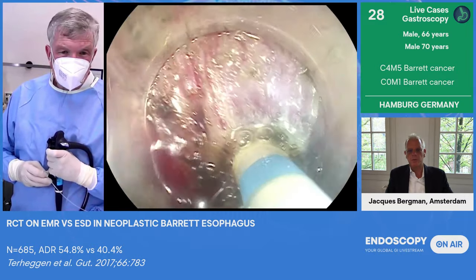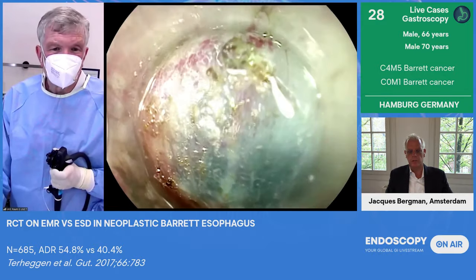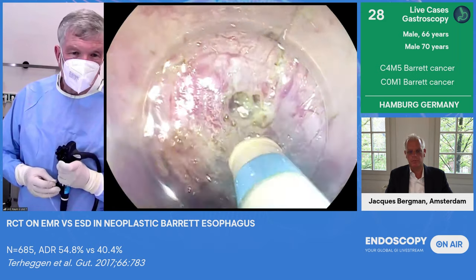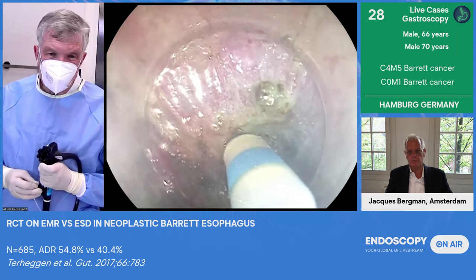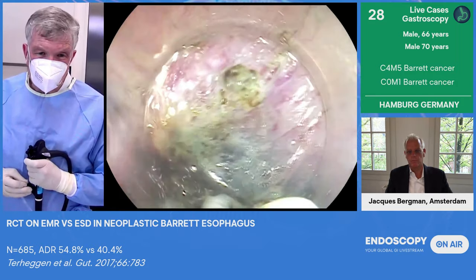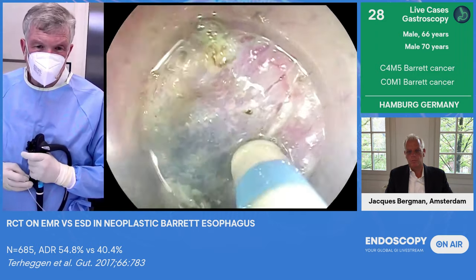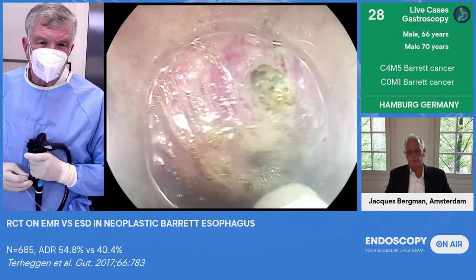So Thomas, what type of knife is this? That's a dual knife. Okay, but the knife is closed then. The knife is closed, which I prefer. Of course, when I'm deep in the submucosa, I can also exit the knife, but I want to get into the right layer first. And that's usually underneath the vessels. So I will go on.